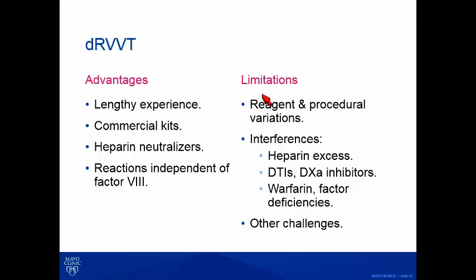Limitations, even with commercial kits: the sensitivities can be variable, and how people use and employ the kits can also vary. And there are lots of interferences, especially from anticoagulants, as well as some other challenges.